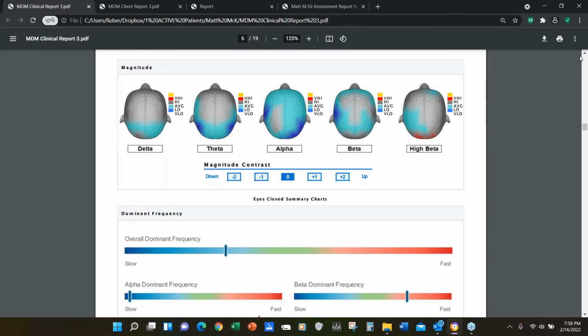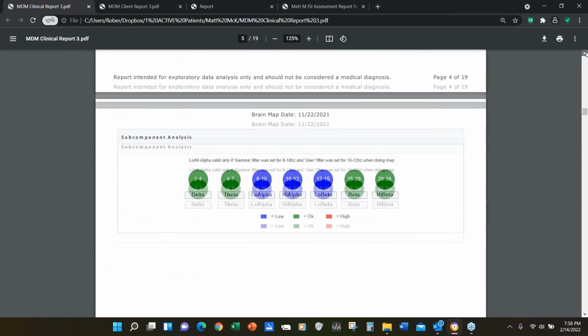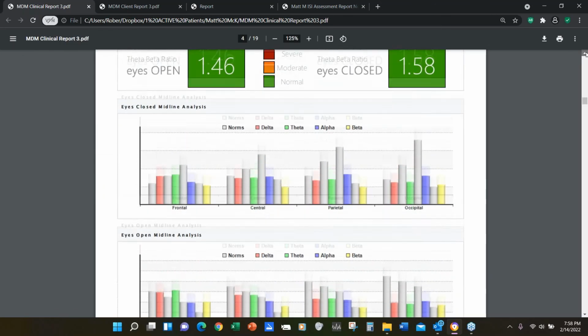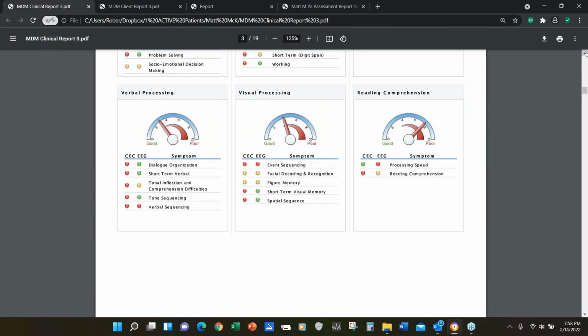So I use that example to explain how beta works. And then I say, in these other waves, and I draw a box around delta, theta, and alpha, they're in charge of carrying that out. But if those waves are going too slow, the little boy's going to go in the room and everything is going to look the same in appeal to him. And more than likely, he'll go to his favorite thing. And 15 minutes later, that's what he's doing.